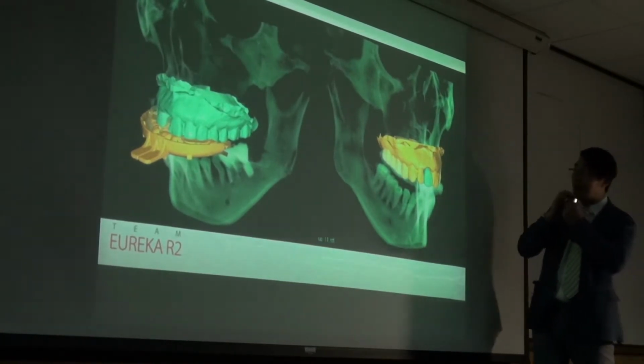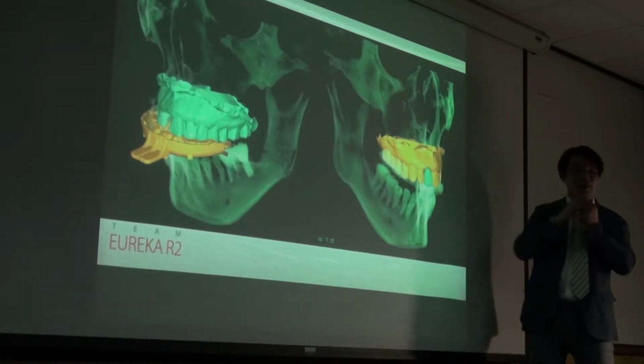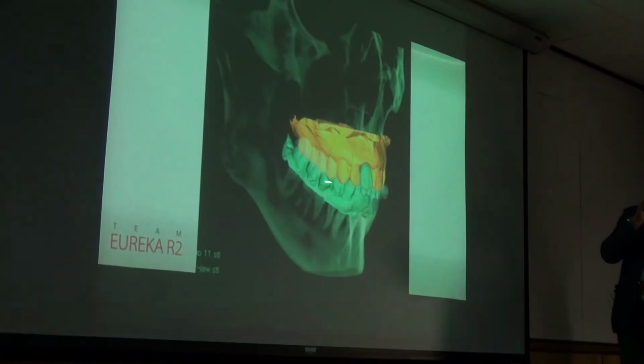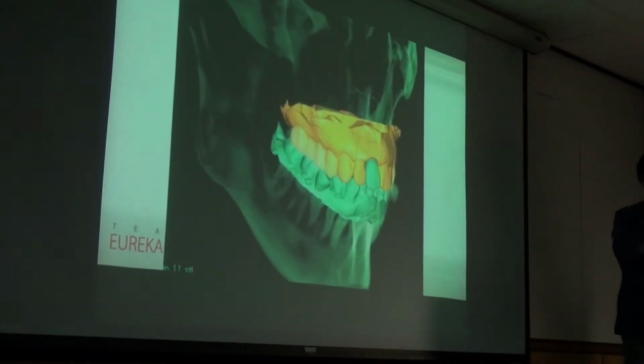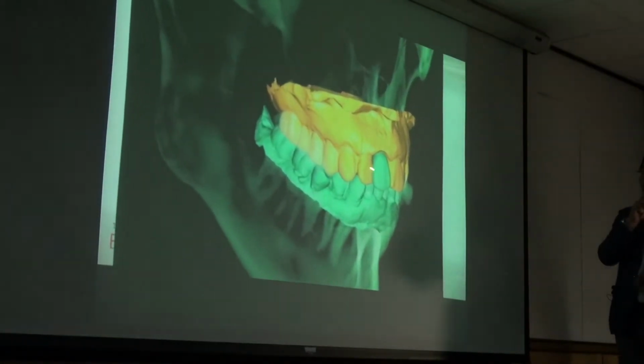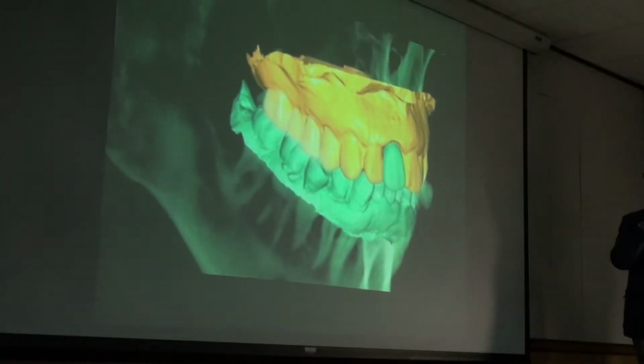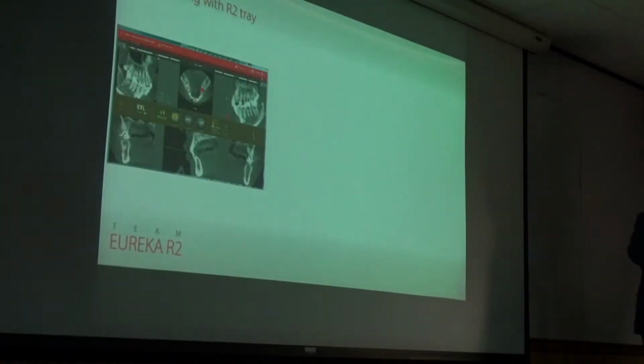So match the operation site first, and then if we load the antagonist, it is the perfect occlusion. Based upon this occlusion, we make the provisional restorations.